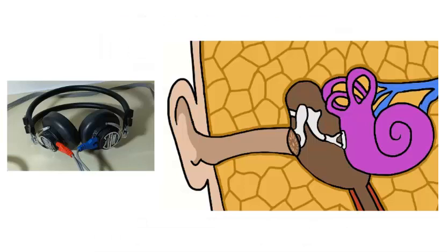This is the reason why we use earphones. We place an earphone on an individual ear and deliver test signals specifically to that ear. In theory, when a person responds to a test signal using this method, we'll be able to know which ear has heard it. However, even when using air conduction devices like earphones, we must be aware that sound signals sometimes don't remain with the ear into which we're delivering the signals. It's possible for air conduction sound to travel away from our targeted test ear and move to the opposite side.